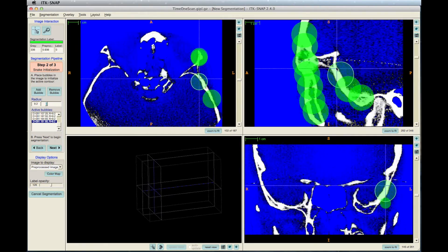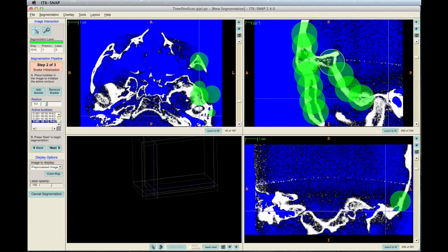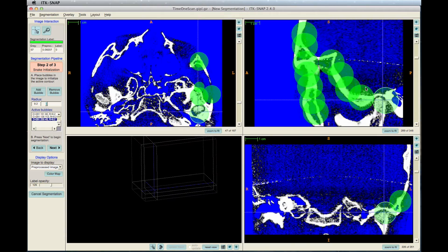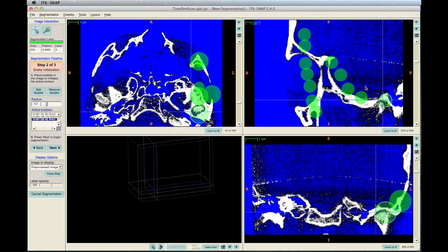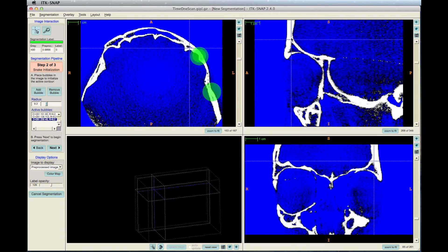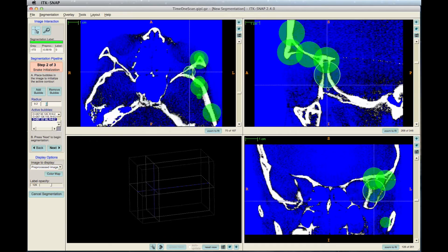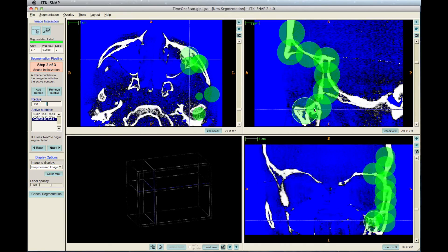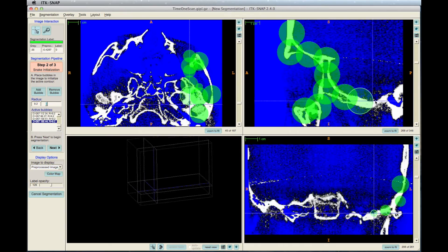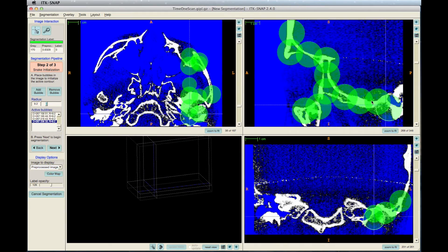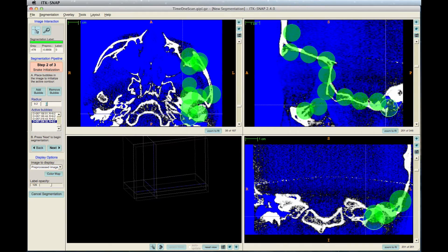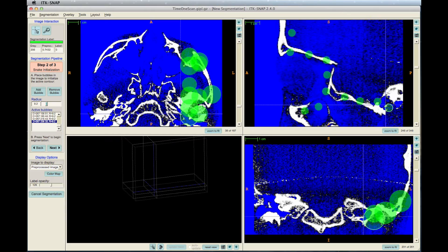Hold your cursor over your selection. Press and hold the left mouse button, and click the plus sign on the keyboard. A bubble will appear by your cursor. Keep doing this through all the slices.